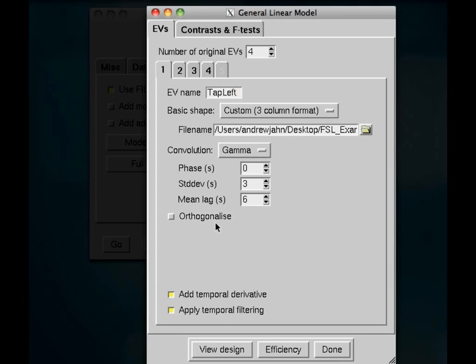Essentially, what this does is it will force the GLM, or your general linear model, to assign equal amounts of variance among your regressors. And you can orthogonalize it with respect to other variables. Usually, we don't do that because it can introduce a lot of biases, and usually we don't know exactly how orthogonal the regressor should be. This should be taken care of in your experimental design rather than forced after the fact.